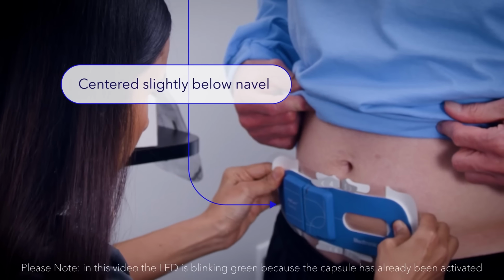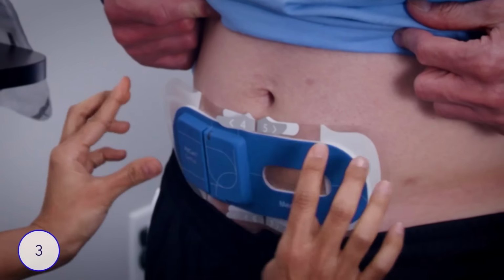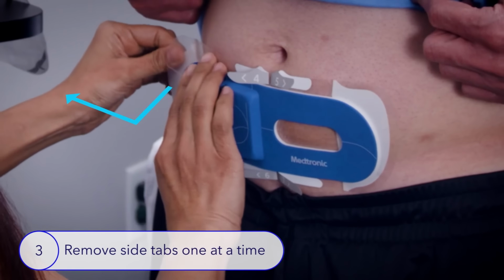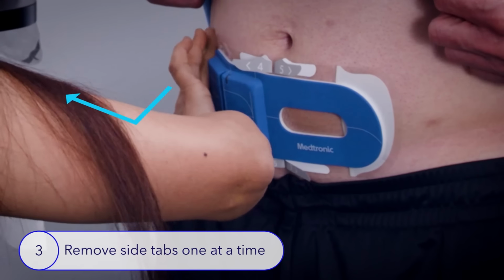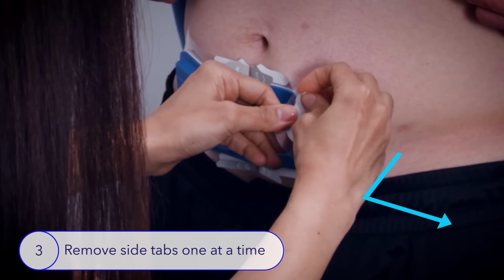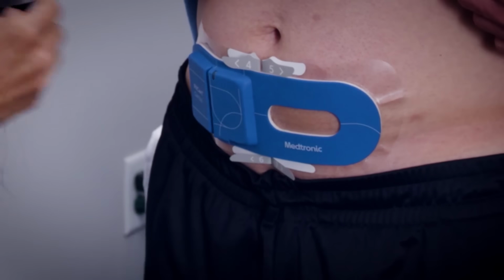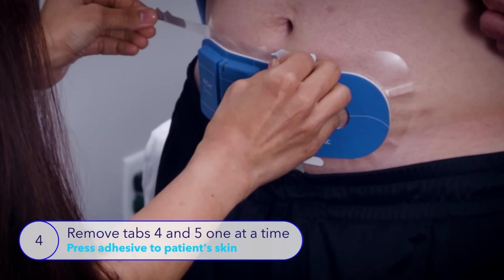Apply that first tab so that the device is slightly below the navel and centered from left to right on the patient's body. Once the first tab is adhered, the 2 side tabs can be removed one at a time. Gently pull each tab away from the center of the device with one hand while maintaining light pressure to hold the device in place with the other hand. Press the adhesive to the patient's abdomen as each tab is removed.